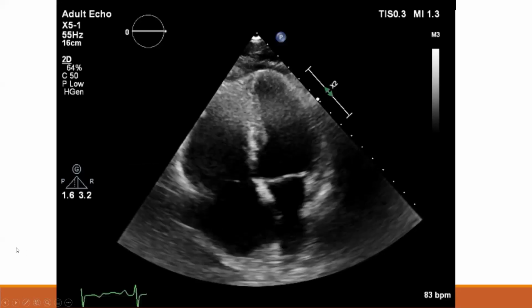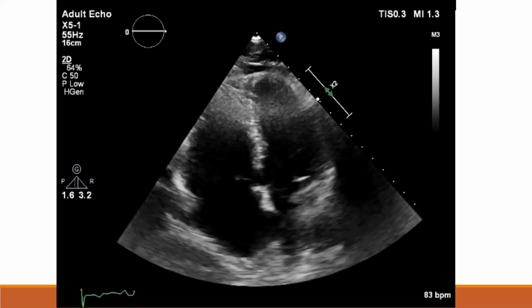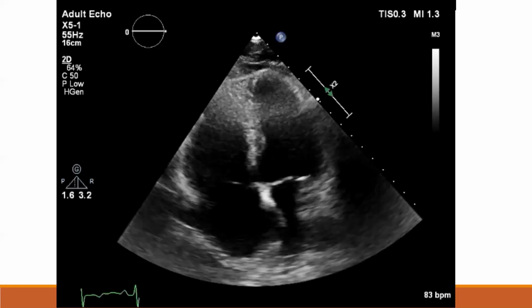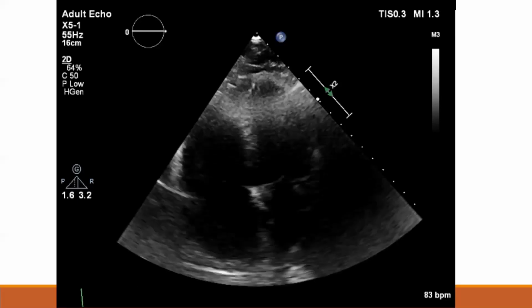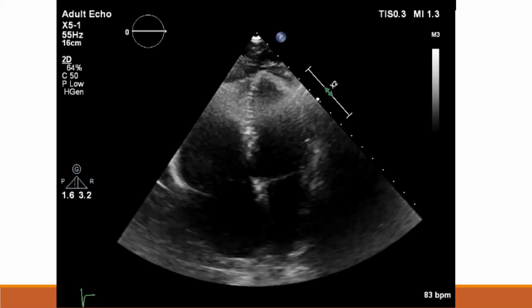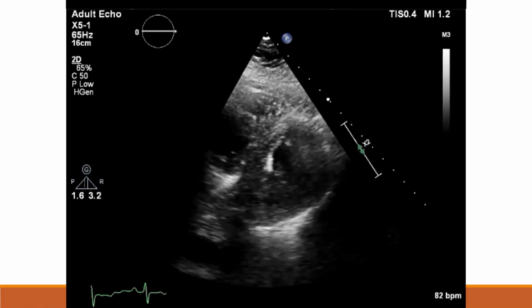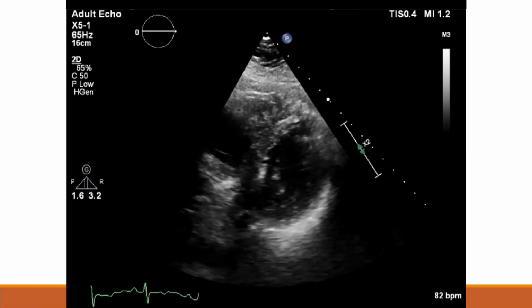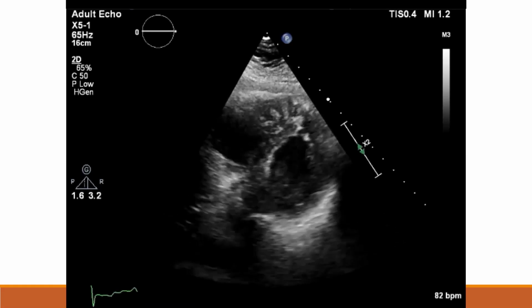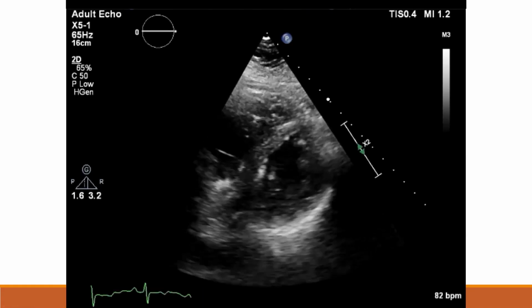Here's her echocardiogram. You can see just looking, the RV is certainly larger than the LV. And there also is a specific pattern that we'll talk about. Here's the short axis view, and you can see that there's septal flattening in diastole, suggesting a right ventricular volume overload.